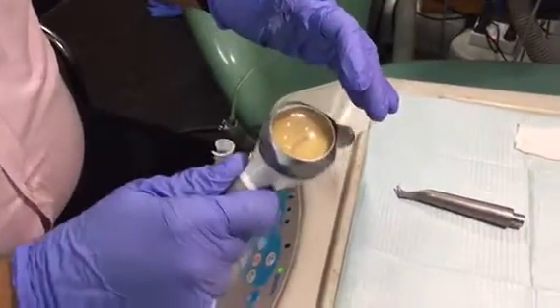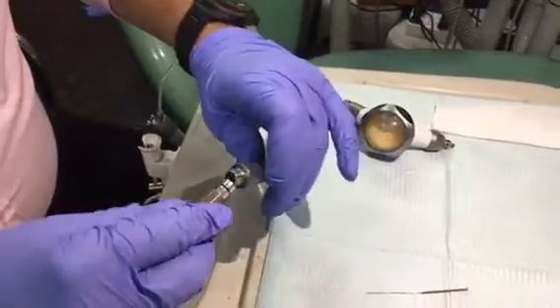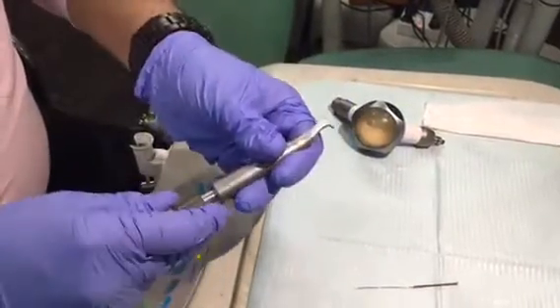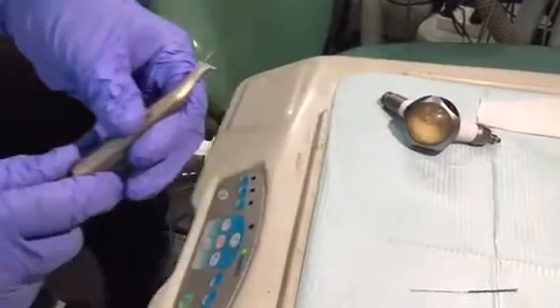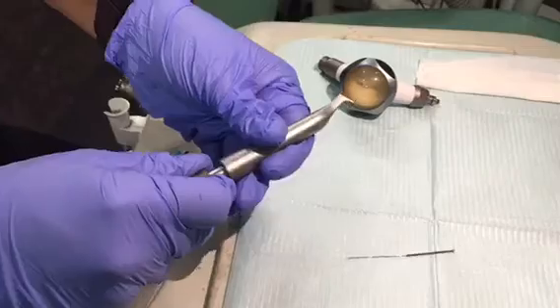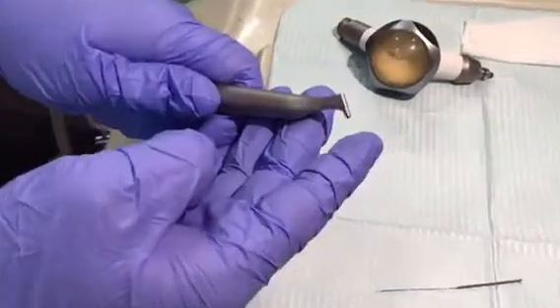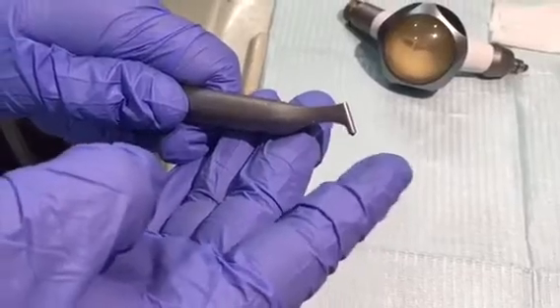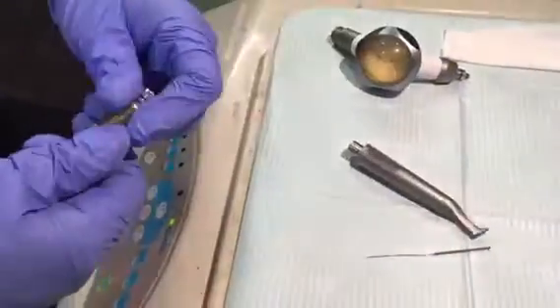with your air rotor pressure. Again, you can also connect it to this end and clean. Make sure that air is coming out from this portion. It should not be blocked. Air should be coming out from this portion.